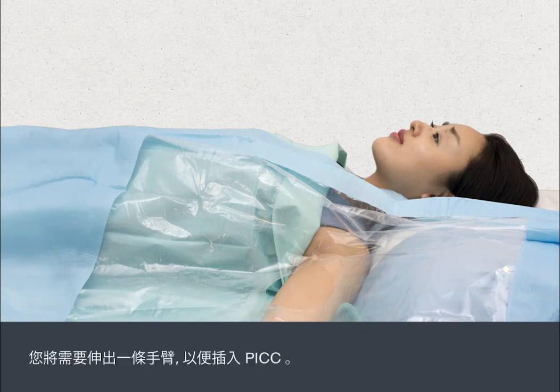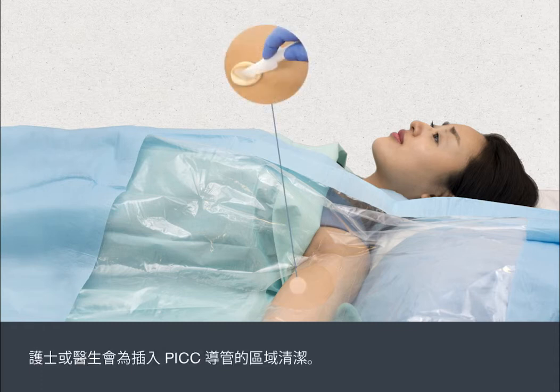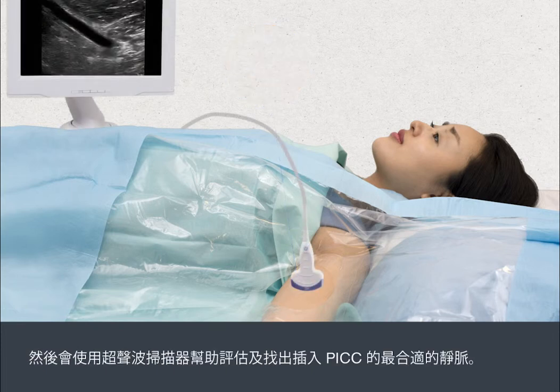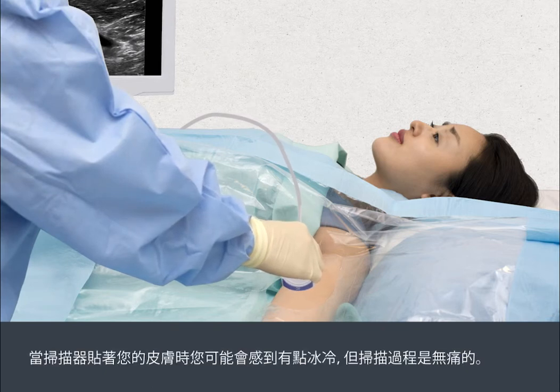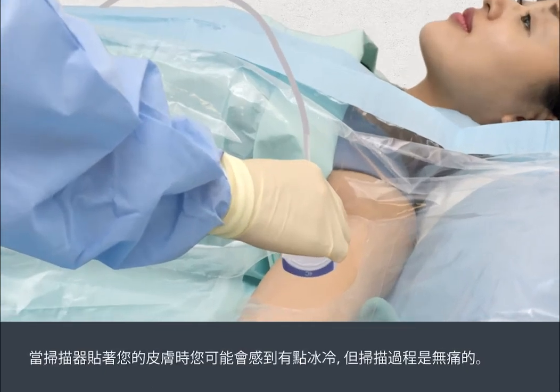You'll need to stretch out one arm to enable the PIC to be inserted. The nurse or doctor will clean the area where the PIC line is to be inserted. An ultrasound scanner is then used to help assess the most suitable vein for insertion of the PIC. The sensor may feel cold against your skin, but the scan is painless.